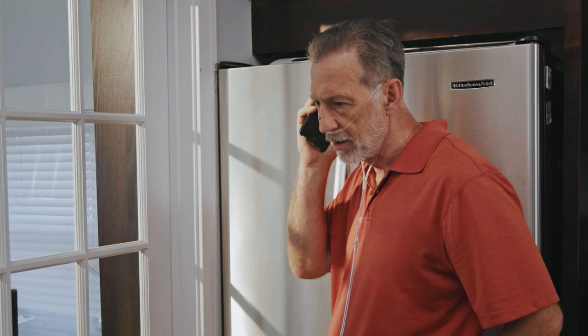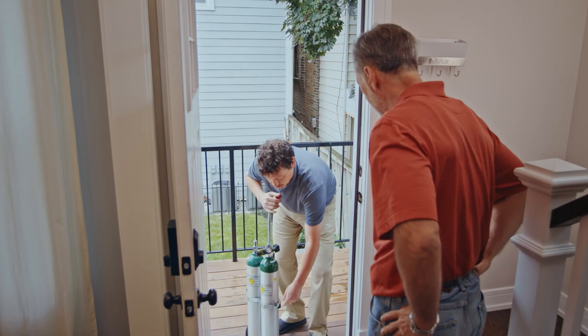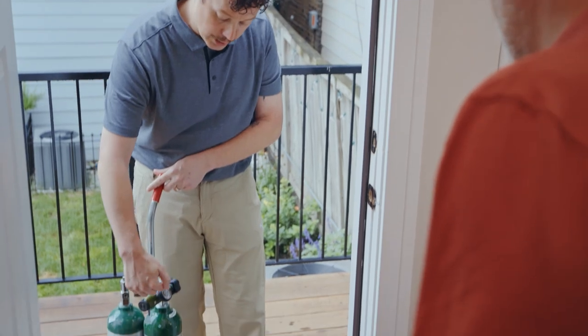Some people will use a conserver device, which delivers oxygen in pulses or bursts when you inhale. This type of device helps you use less oxygen, but it is not right for everyone. Ask your doctor if using a pulse flow is right for you. When your oxygen is delivered by the company, the supplier will show you how to begin the flow of oxygen and also turn it off.